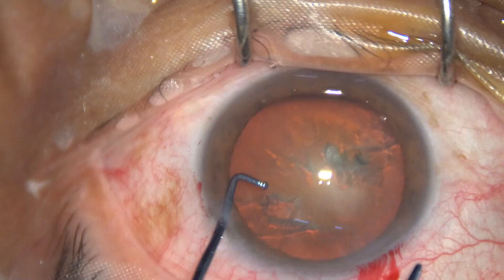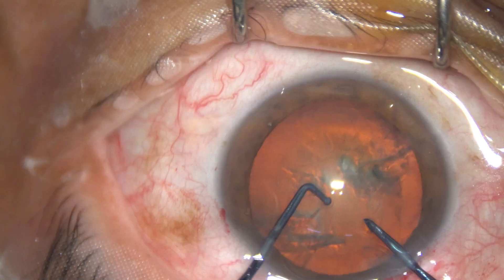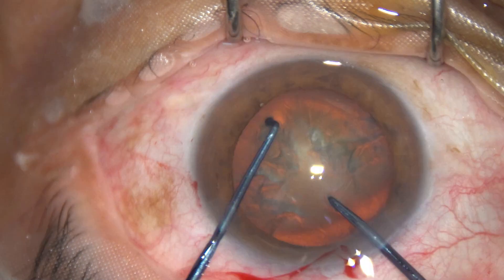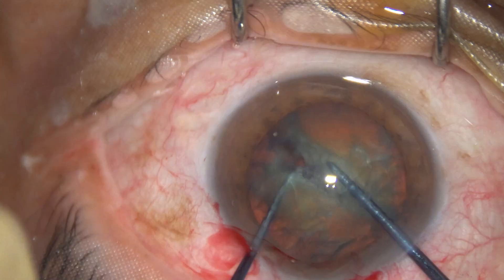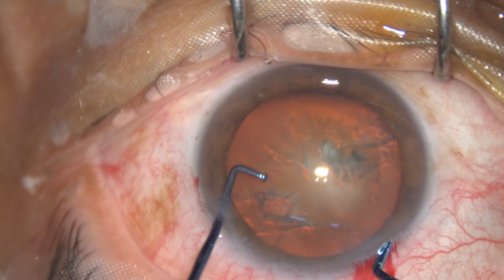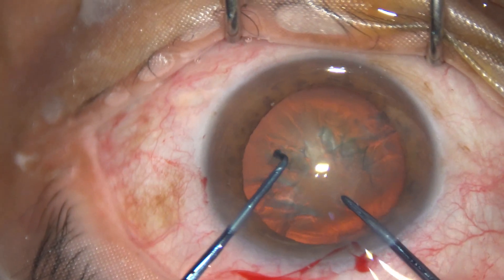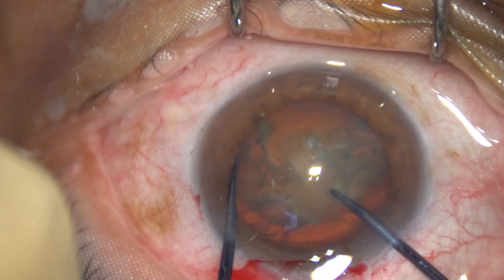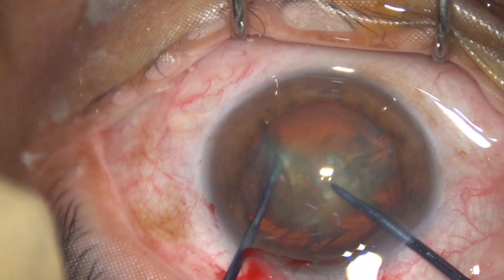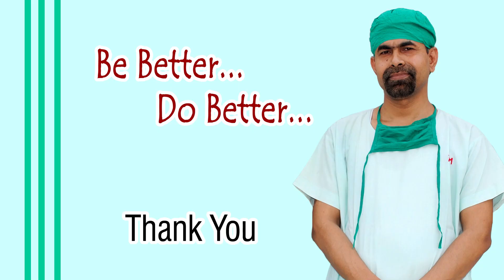Now see the steps. First the sustainer goes in, then the Prechopper goes in, and the Prechopper engages into the soft part of the nucleus just in front of the main wound. The sustainer goes towards the opposite equator and the opposite equator is hooked. The two instruments are brought to each other and lateral separation is done. See these steps in slow motion: the Prechopper goes in, engages the soft part, the sustainer hooks the equator, and the two instruments are brought to each other. The front cutting edge of the Prechopper is sharp and you can divide the nucleus into two hemi nuclei.